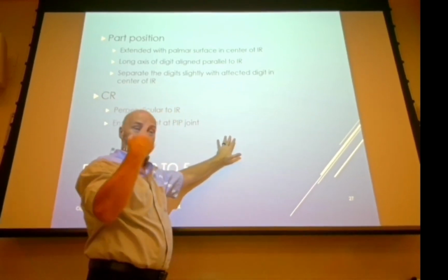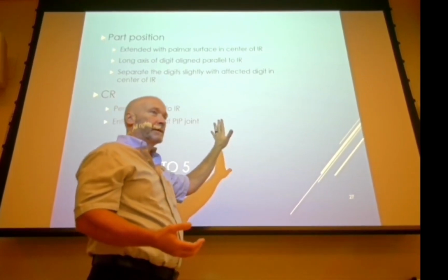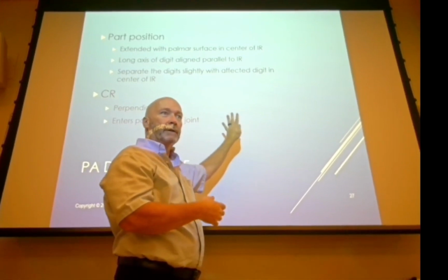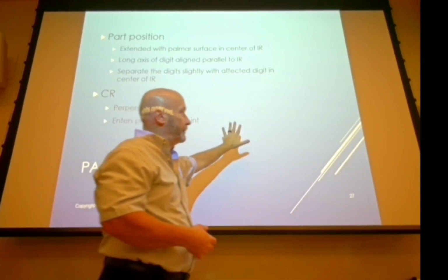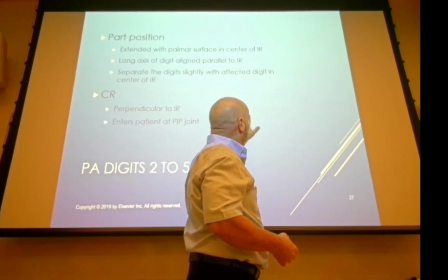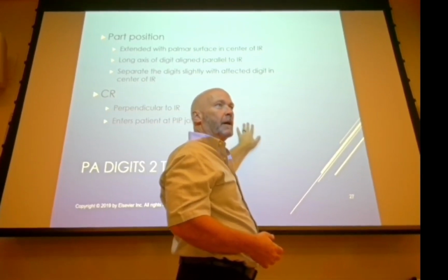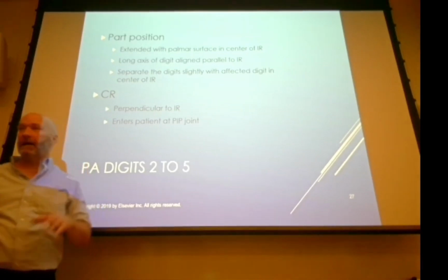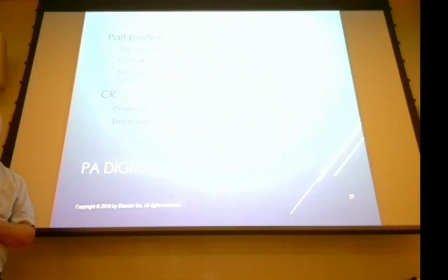Okay, so make sure that you consider the thumb too, and make sure it's in the light as well, even if you have to bring it in a little bit. That's what we refer to as adduction. Abduction means taking away, right? And adduction means to bring it back in. Don't adduct it to this point, but you can bring it in a little bit and make sure that you don't clip it. Okay. Probably the most common first semester positioning error of hands that I ever saw when I was clinical instructor or working on the clinical side.